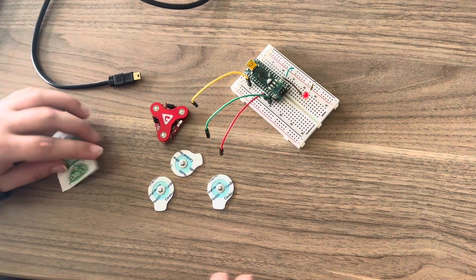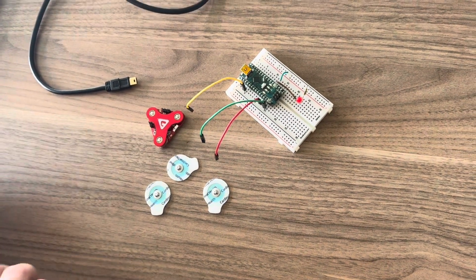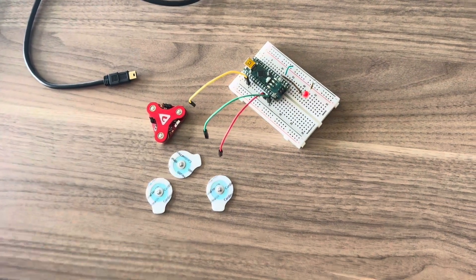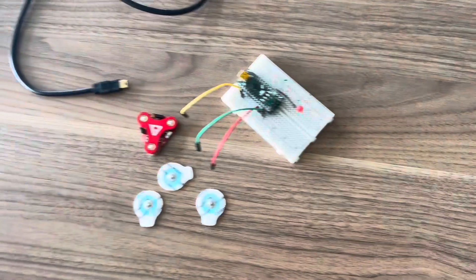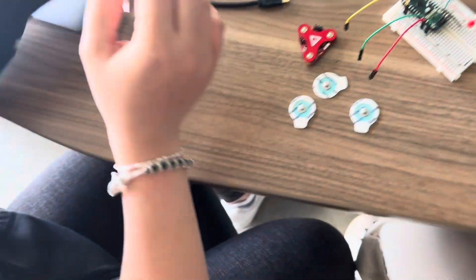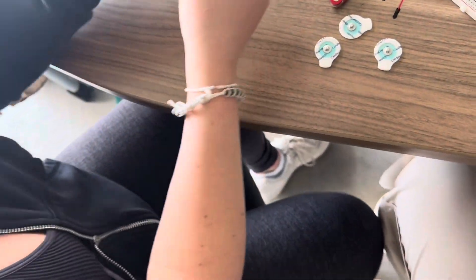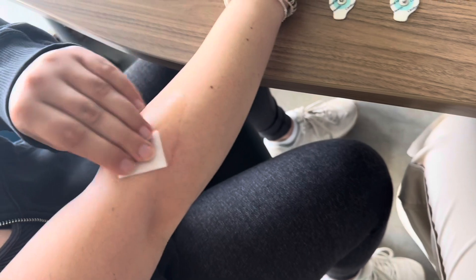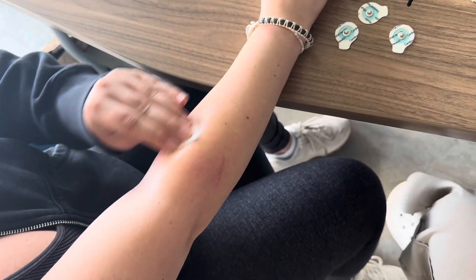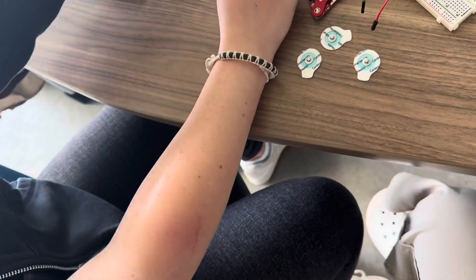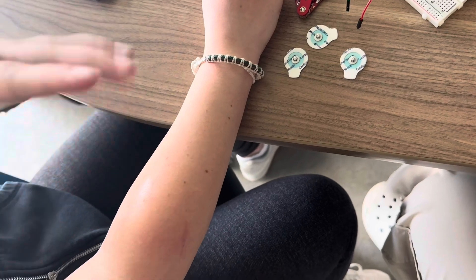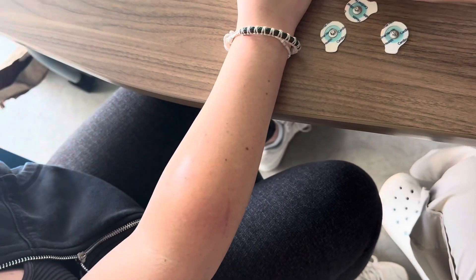First you start with an alcohol prep pad to clean the area that the sensors are going to be going on. As you can see here we're going to place the sensors on the upper arm. We're cleaning the area and then we let it dry.